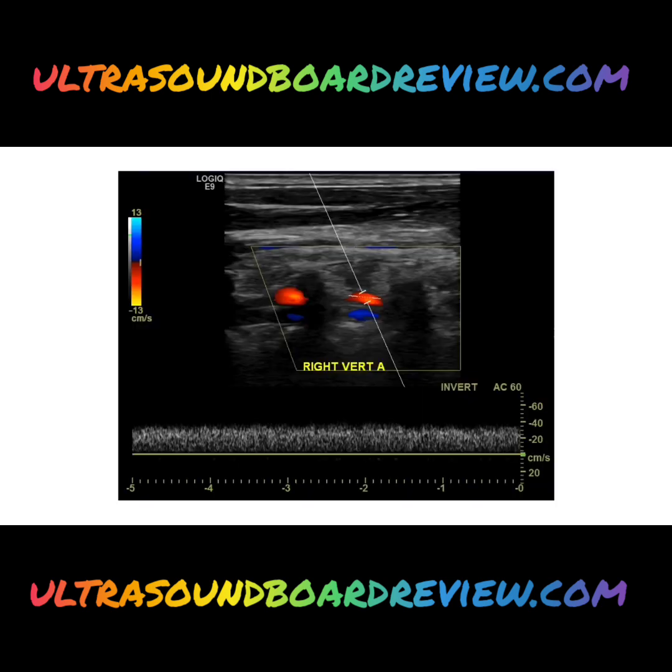So here's an interesting case. Look at this vertebral artery waveform, WTF. Let's do some investigating here. First, where is our probe? It's a steered box, so let's draw the lines. And we want the line that's outside of the box. That's the side that our transducer's on.